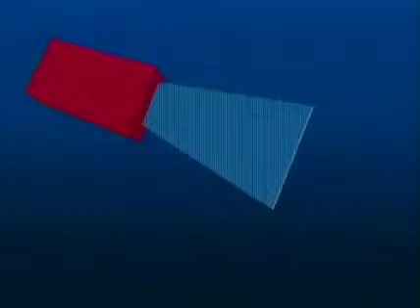But when I watch different people do ultrasound biopsies for the first time, I often note they watch the screen to see where the needle is instead of seeing where the needle is in relationship to the transducer. So initially watch where that needle is in relationship to the transducer, or you'll be out of plane.